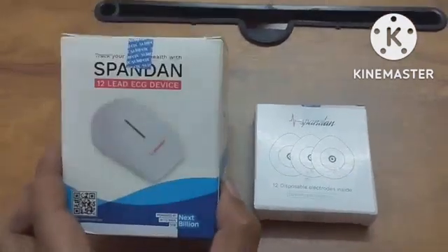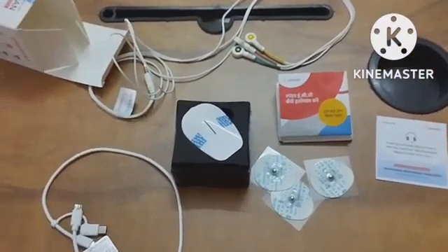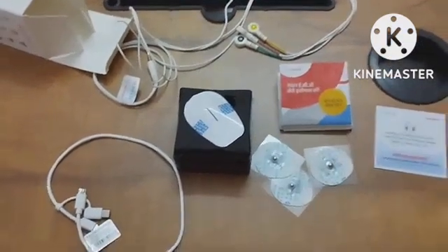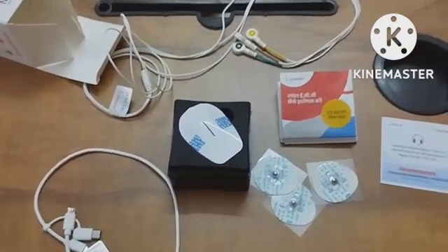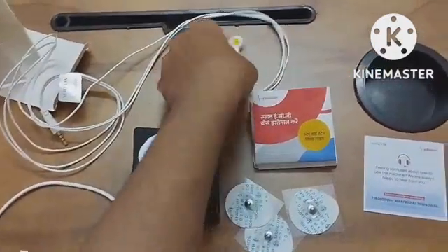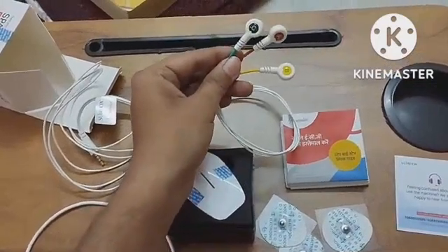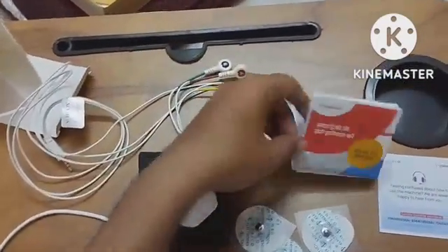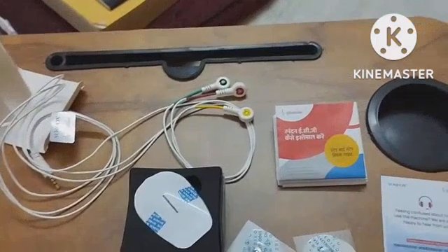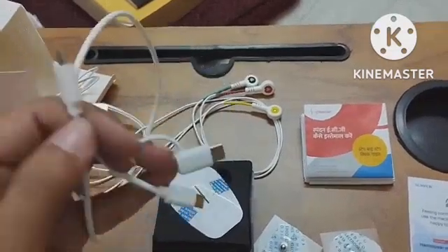Now I will show you what's inside this box. So you can see here we have unboxed the device. Here you can see one cable with three electrode attachments, a user manual, and one cable which is attached to the mobile as well as the device.